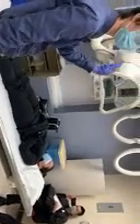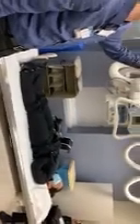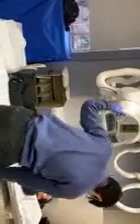Anytime you're here on the bucky, we're going to be at a 40-inch SID, right? Just make sure that it locks in and it gives you a green light. If you don't have the green light, double check everything, double check your locks laterally, double check your locks vertically, and then double check to make sure your detent is on. I'm going to go ahead and line up our tube with the bucky here. And then, let's see, turn off these lights.